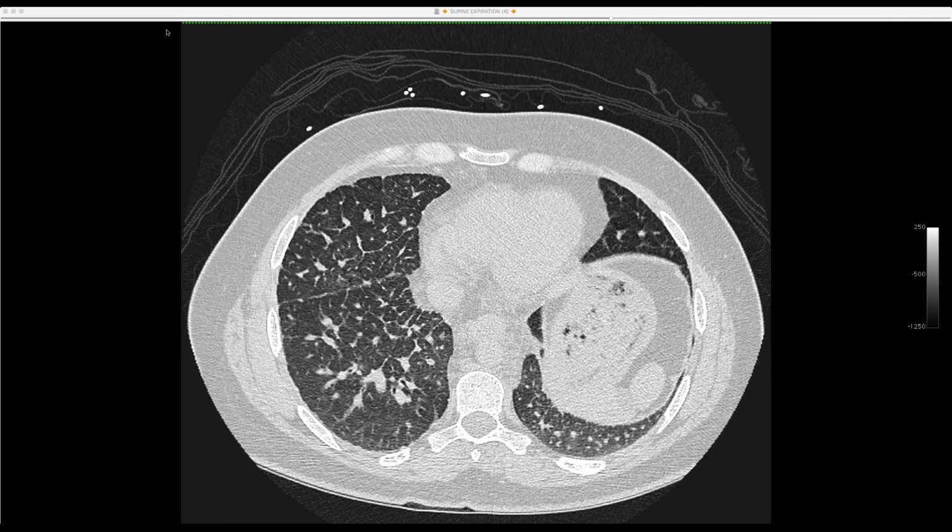There is an association apparently. And then we tried to see if there was some timing with the imaging findings and the IgG infusions, but that first CT I showed predated his IgG deficiency. So maybe he's spilling IgG into his lymphs, and that's why he's deficient. Well, I don't know. We'll find out, but I thought it was perfect timing because of your case. So, okay, well, let me show this other case because I got confirmation on this one.